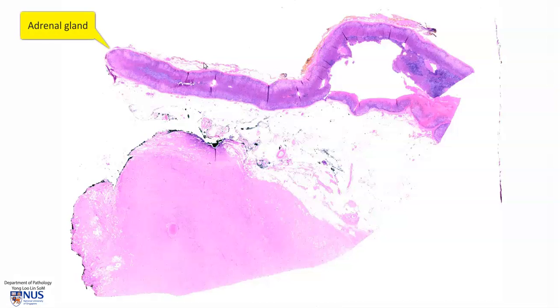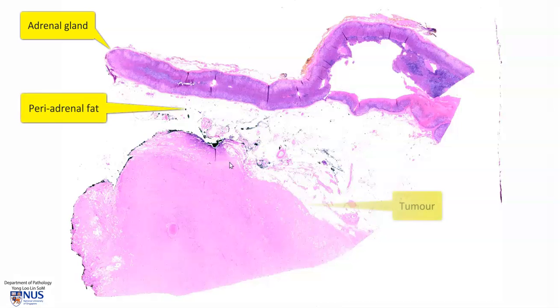We have the adrenal gland here, which is normal, periadrenal fat, and we have the tumor.